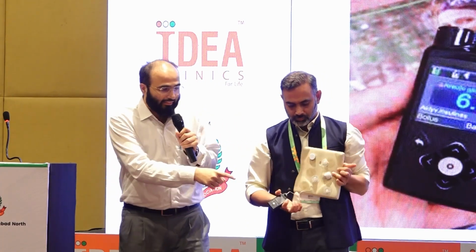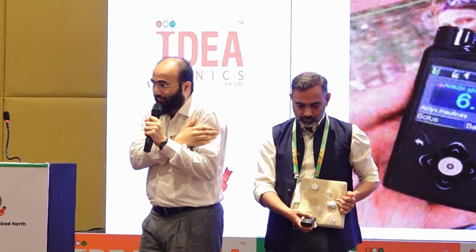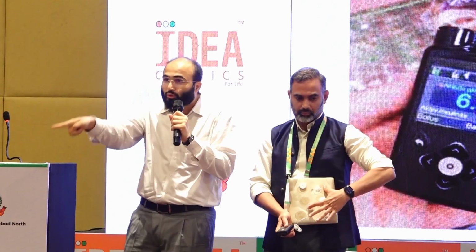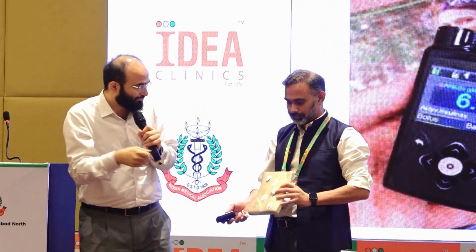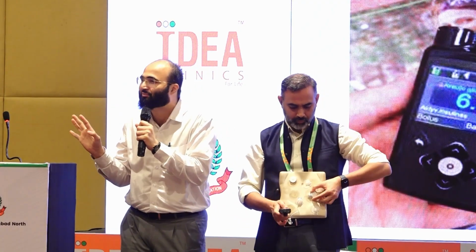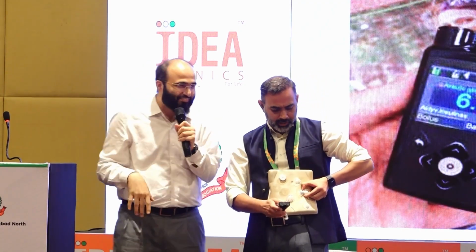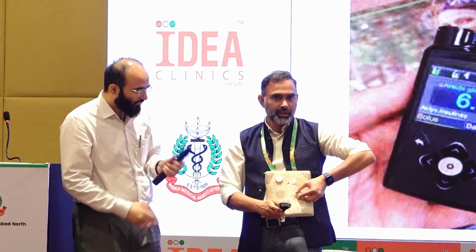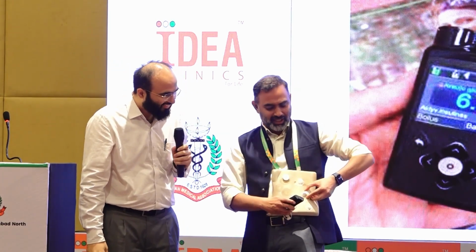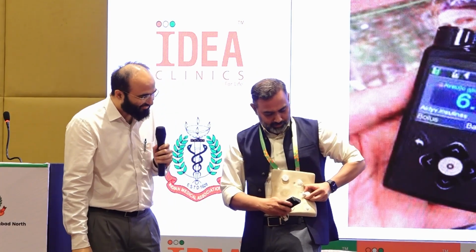Right? And there is a sensor on the hand. This sensor transmits glucose to the pump every 5 minutes. This is the sensor. This is a transmitter. This transmitter costs 70,000 rupees, by the way. So you can take out the transmitter from the pump and reattach it. It's like a battery chargeable transmitter. It's sticky. It comes out.